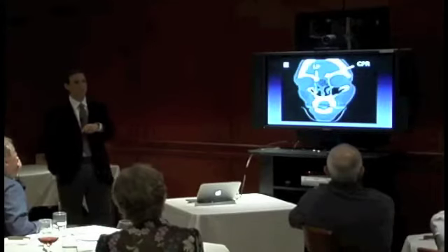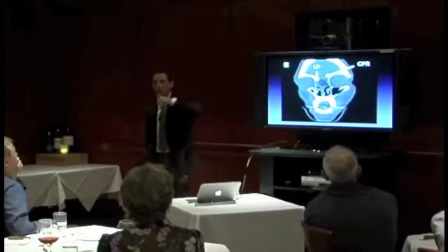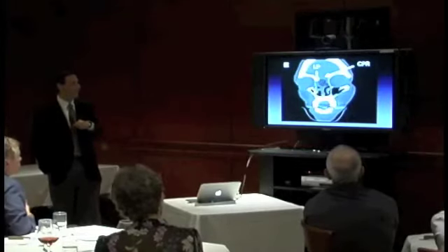This is kind of what the post-op image looks like on this patient, and you can see that their whole cribriform plate is now gone. And you see the lamina papyracea, and it kind of confirms that we were actually to both sides. This patient actually did very well.